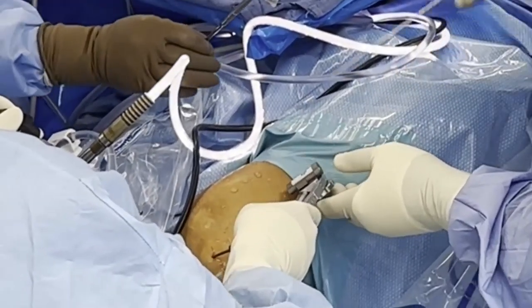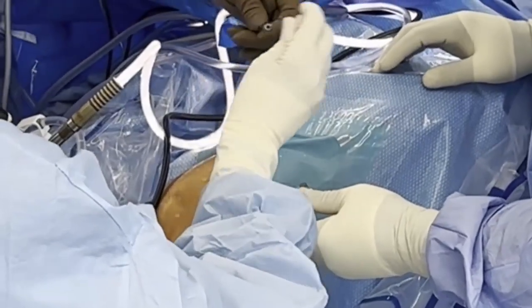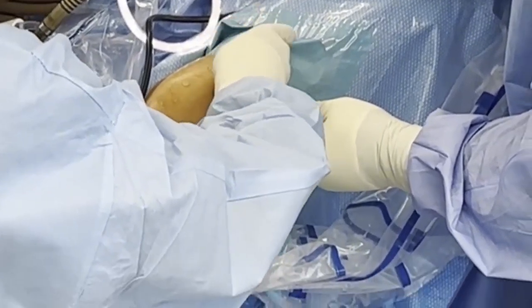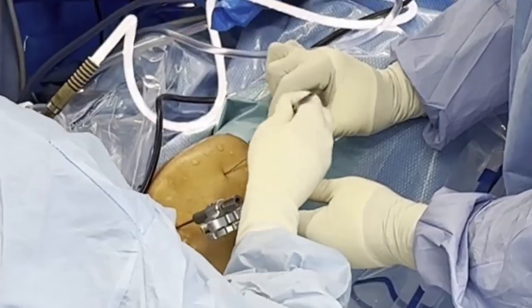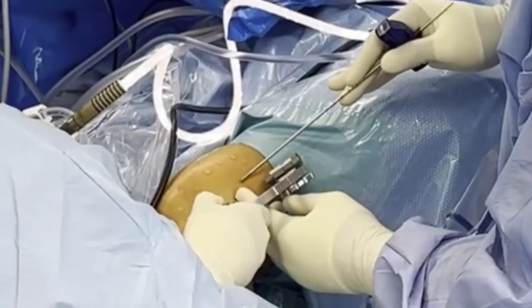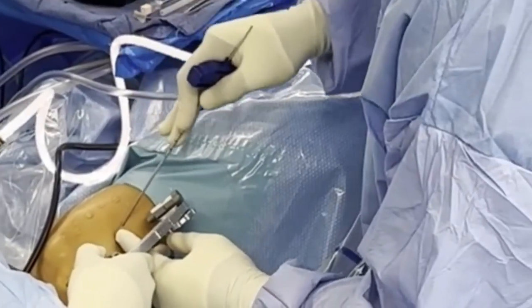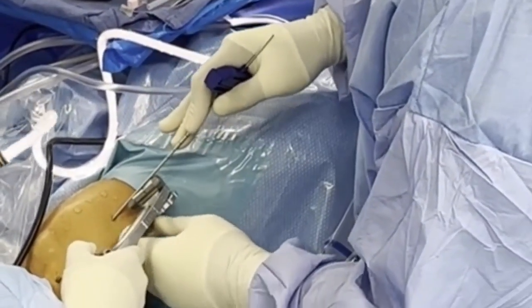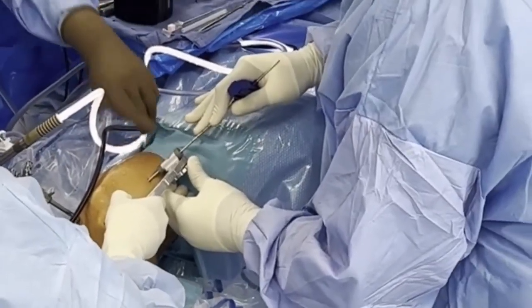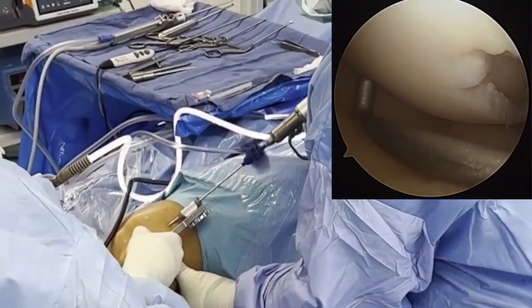It is then withdrawn and the guide rotated slightly away, taking care to maintain the probe on the arthroscopic reference point. A spinal needle is placed through the indented area to palpate the bony cortex and identify the optimal entry point into the bone. A small stab wound is made in the skin through which the delivery cannula is passed, maintaining the angle and placed against the bone. The guide is then rotated back with the housing open to encage the delivery cannula. The slot is then closed and now serves as a drill sleeve. Drilling is then performed to enter the bone marrow lesion with precision and consistency.